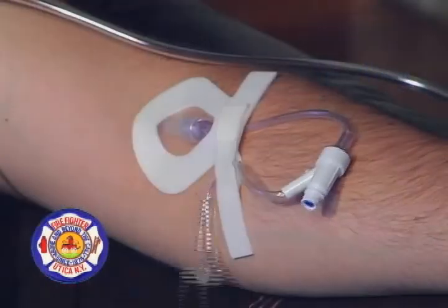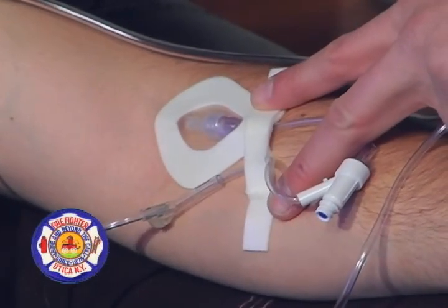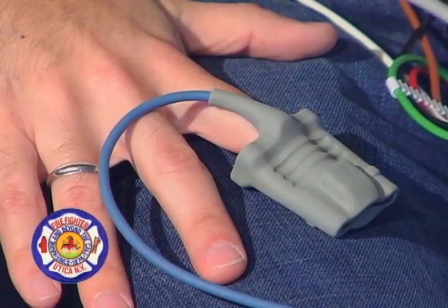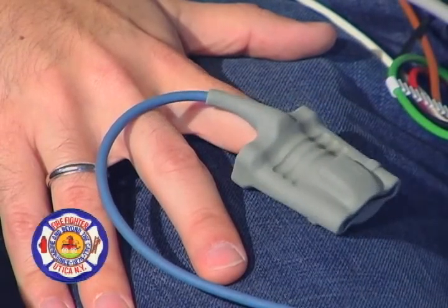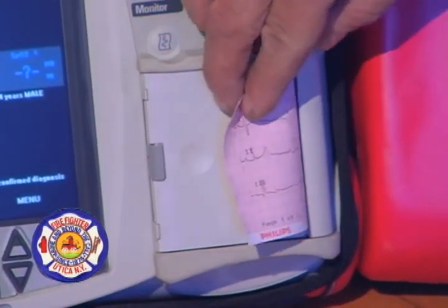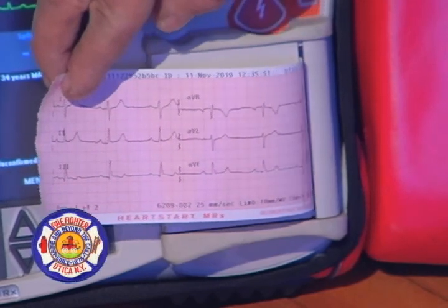Now this created some delays. Once the patient got into the hospital, the doctors in the emergency room would take a look at the monitor, they would look at the patient, and they would make a decision as to what was going on. And then the time that it took between the time that decision was made until some definitive care, some therapy was instituted was quite some time.